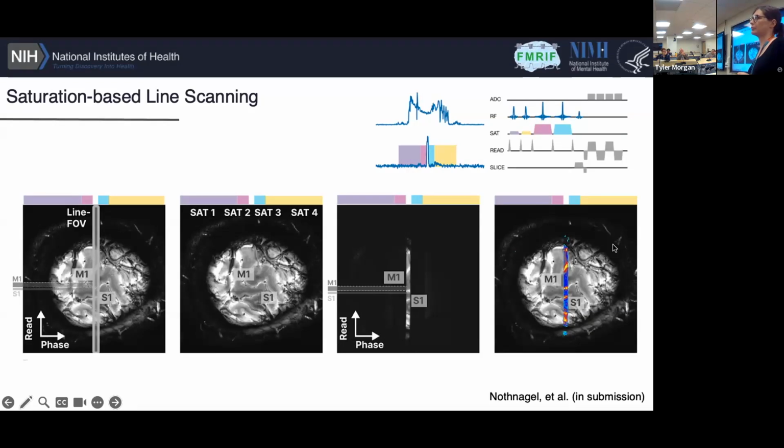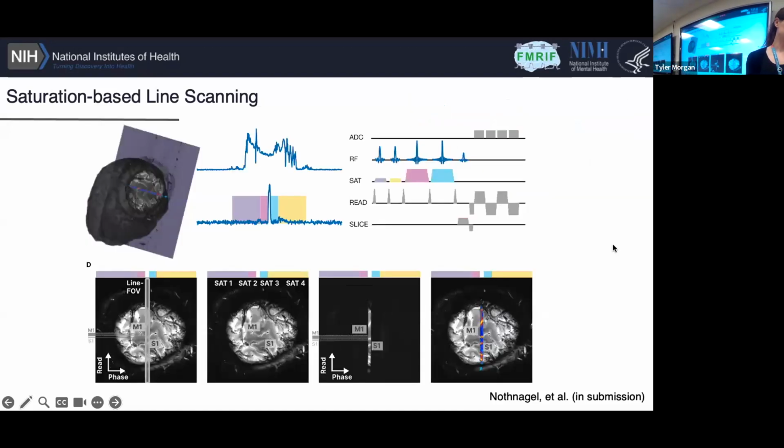We absolutely do. We have a lot of limits for sure. And you'll see a little bit more. We also have some limits based just on that thickness. So for instance, if you're 3 millimeters wide and your cortex is curving through it, your voxels, which are, because of this profile, very thin through cortex, but very, very wide along cortex, if the layers are actually curving through them, that can cause some issues. But we try to combat that.